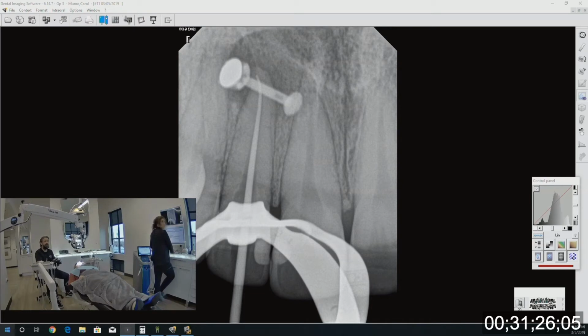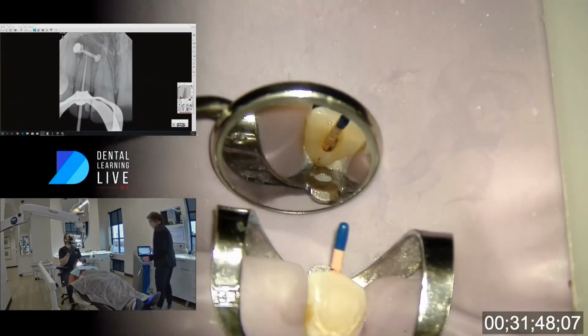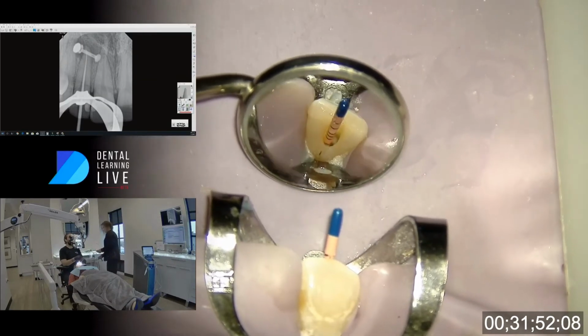The idea is we still want to control the obturation materials inside the tooth, but if anything's open laterally or apically, I do want to fill that. And so I used to coat a cone with sealer and do kind of a continuous, my version of a continuous wave technique. Now what I do, I'll demonstrate it. We're going to inject inside here once I make sure this is completely dry. So, yeah, let's take this out.